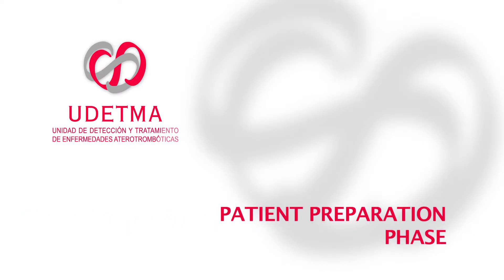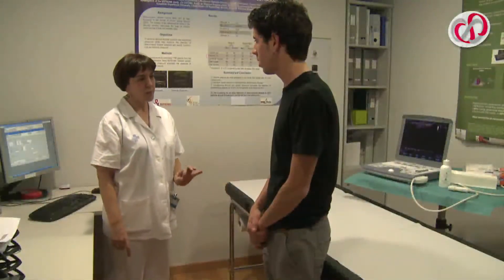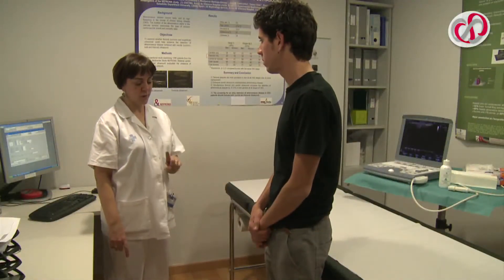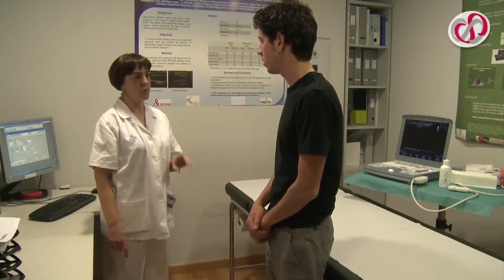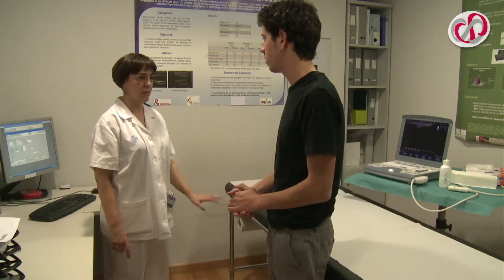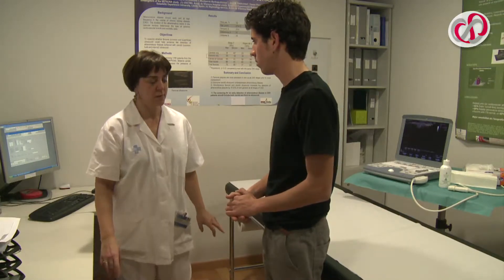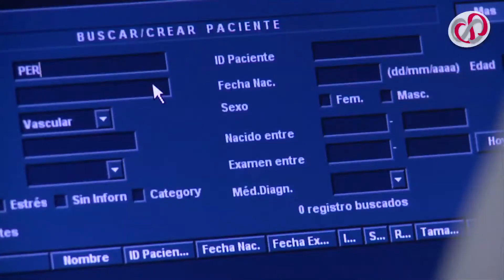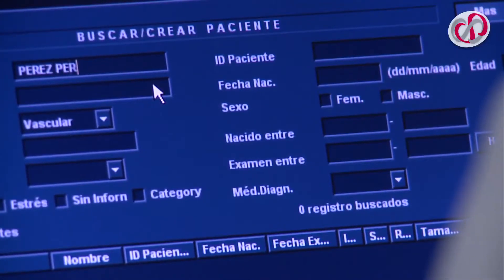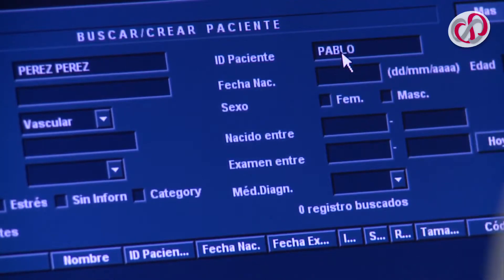Patient Preparation Phase – Firstly, we inform the patient of the exploration that will take place and he or she removes their clothes from the waist downwards, leaving their underwear on. The patient lies in the supine position on the examining table. We then introduce the patient's personal data into the ultrasound.